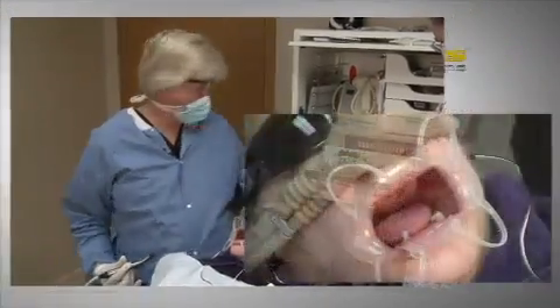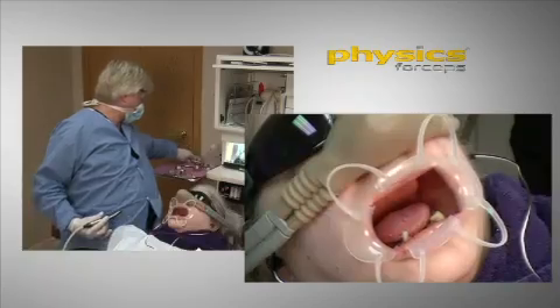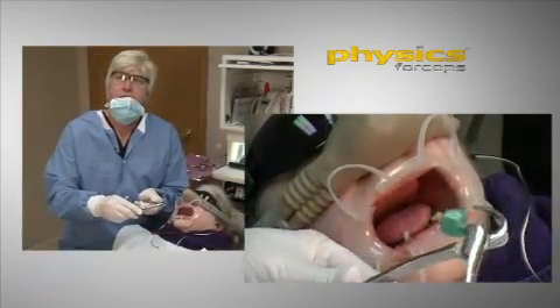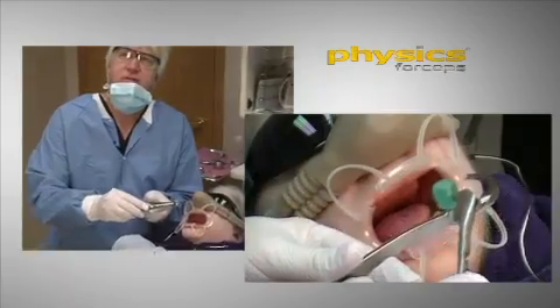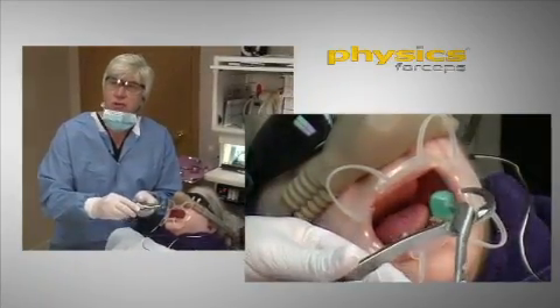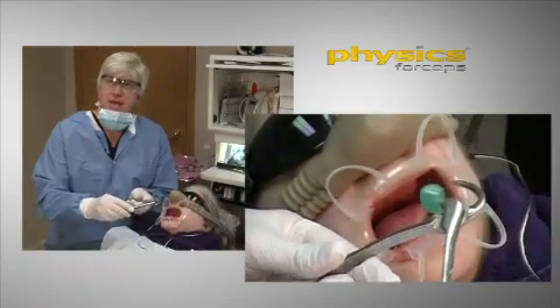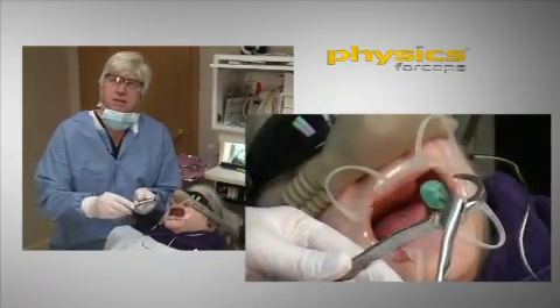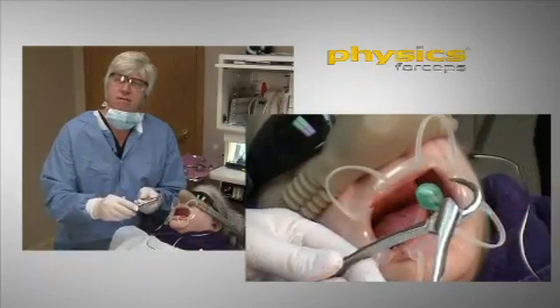The beak, as we've demonstrated, the beak is flat. You can see that pretty clearly on that view. So teeth are often elliptical in shape, or concave, convex in shape, and not often, but sometimes it'll slip off.